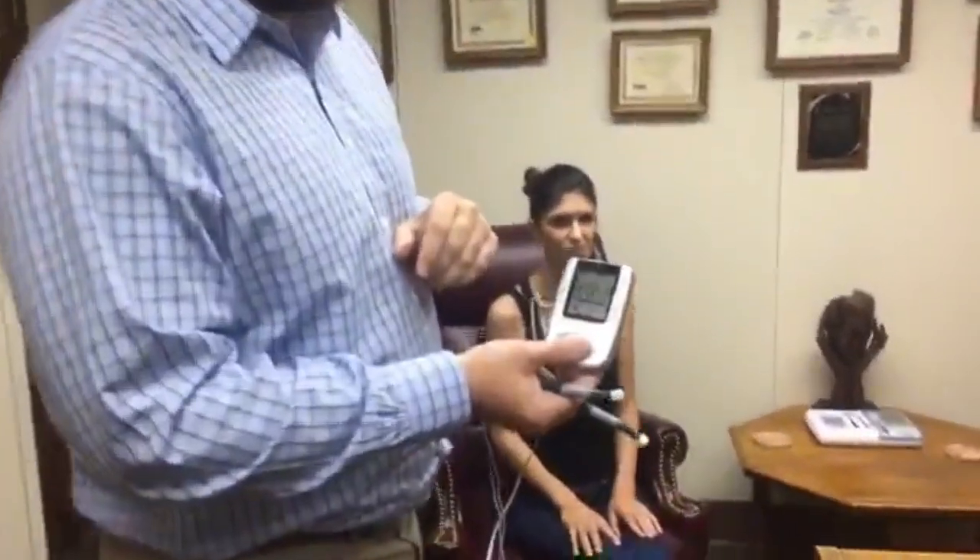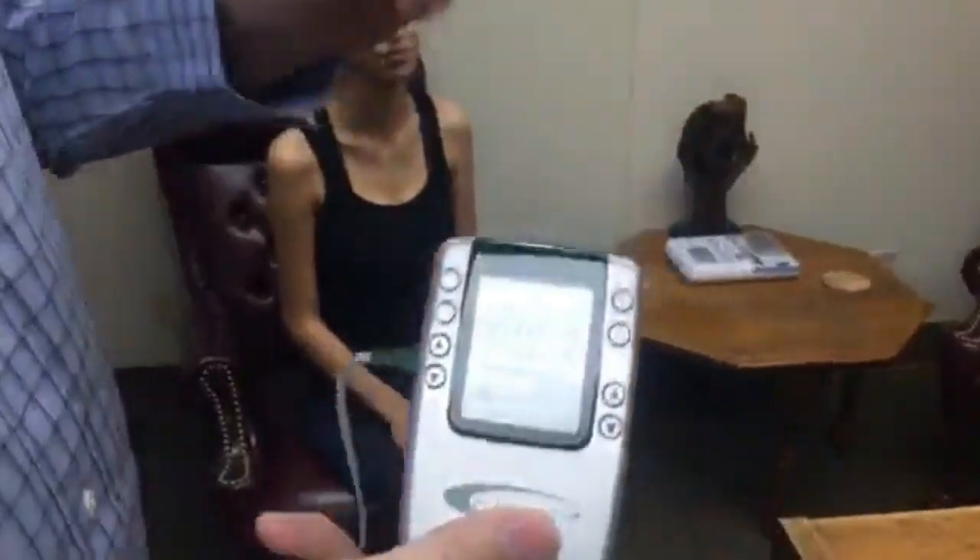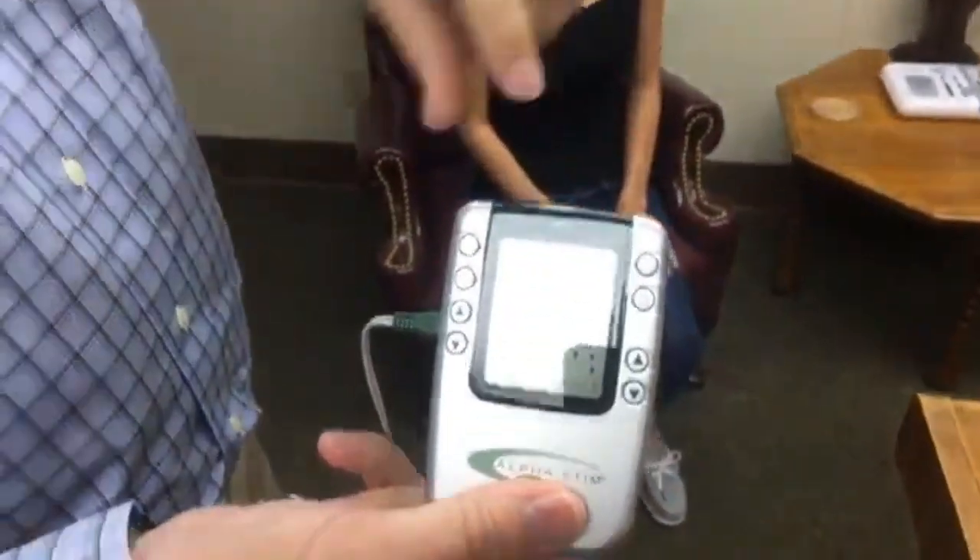First, we're going to show some of the basics — how to treat the shoulder, how to treat the neck — but we also want to make sure you get your device set up properly. We're going to go through the settings really quick, just some troubleshooting, to make sure you're getting the right results and everything you should be seeing.